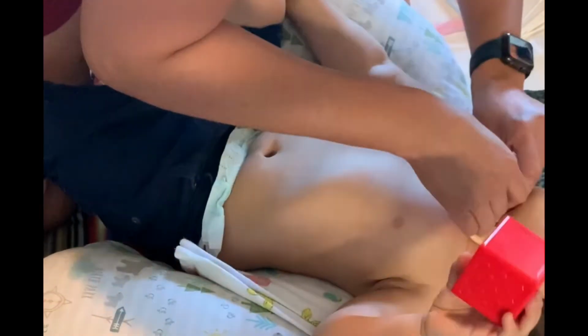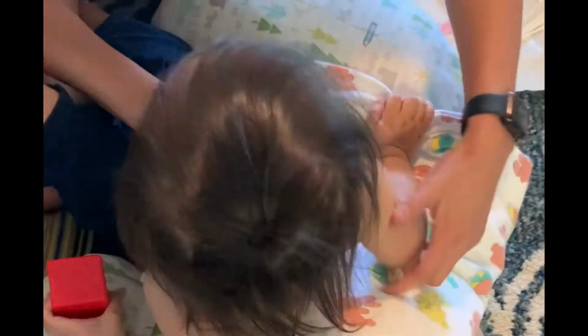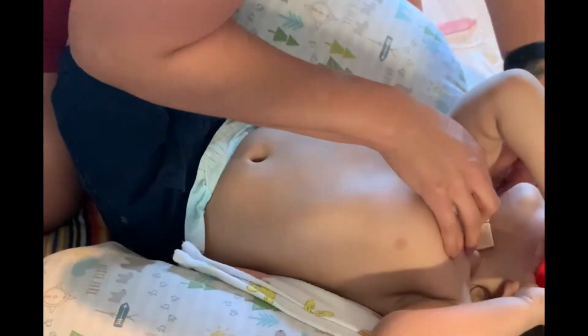Some of you guys may have noticed that I'm not wearing gloves. It's actually easier for Xavier and I to not wear gloves while doing his trach change, just because the lube gets everywhere and it actually feels not as secure. It's more slippery in a way, so that's why we don't use gloves. But our hands are clean, don't worry.